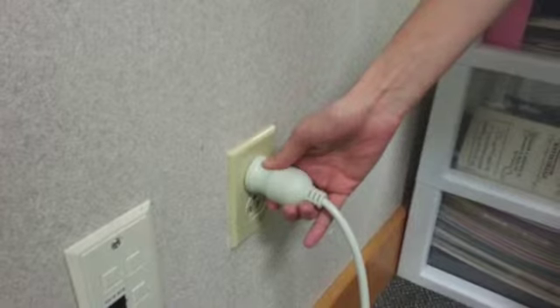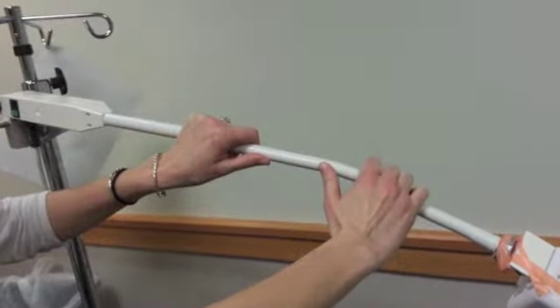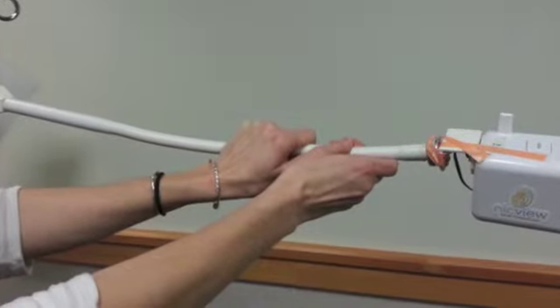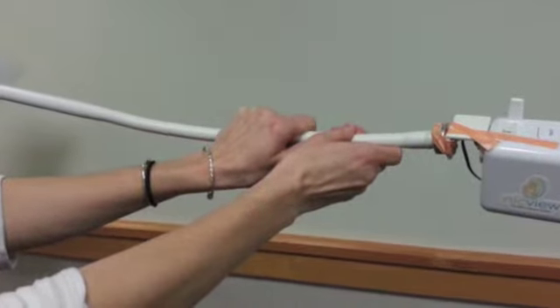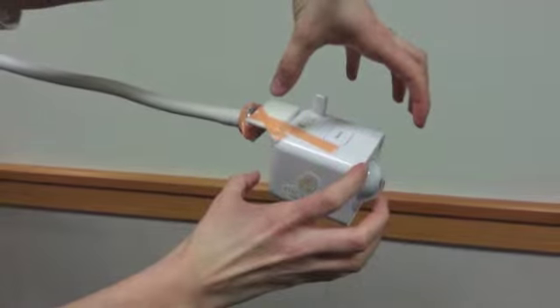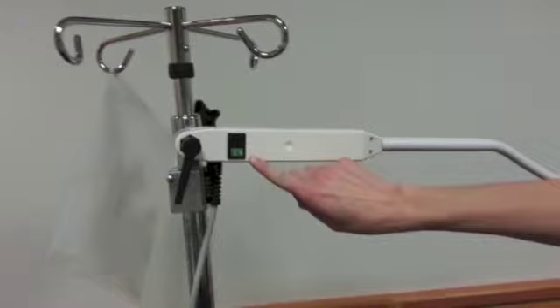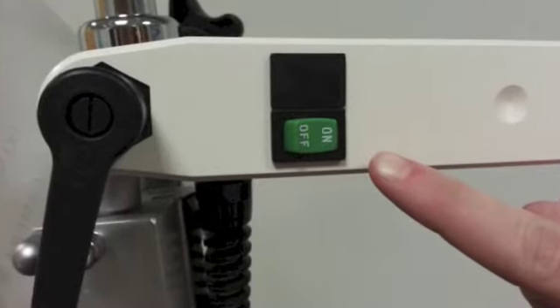First, check to ensure that your camera is plugged into the wall. Then, using the adjustable arm, position the camera so that it is 6 to 8 inches away from the patient. Be sure to avoid positioning the camera directly over the infant. Also avoid adjusting from the head of the camera, as it can cause damage to the system. Locate the green power button and ensure that the green switch is flipped to on.